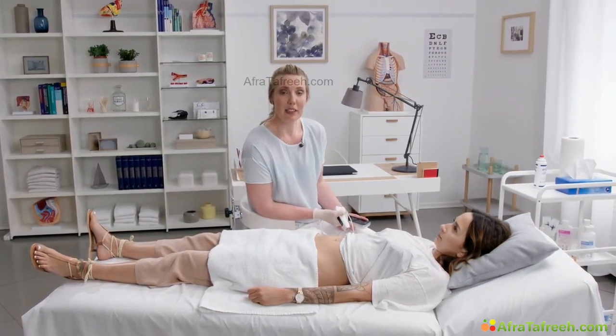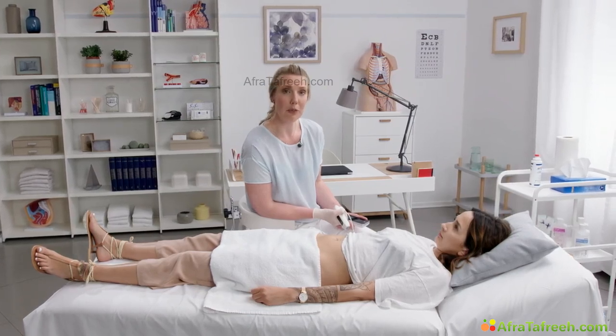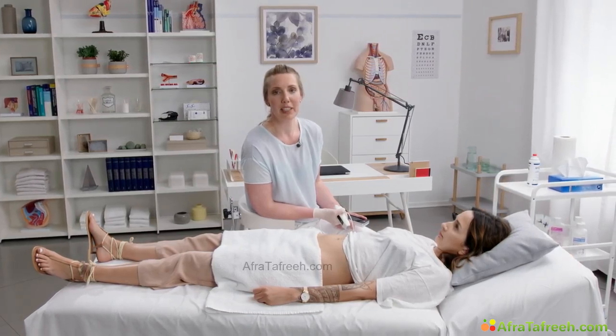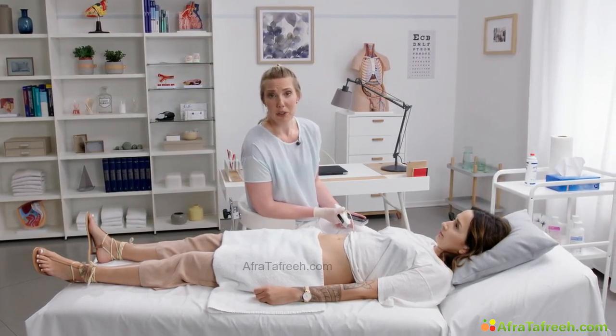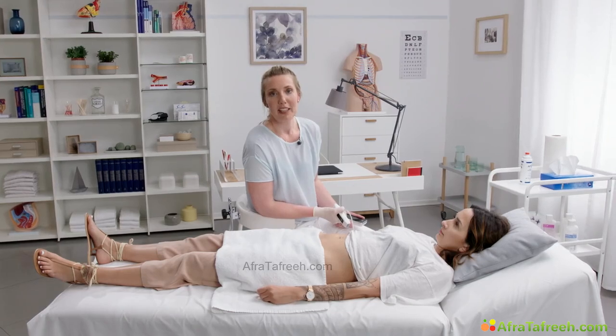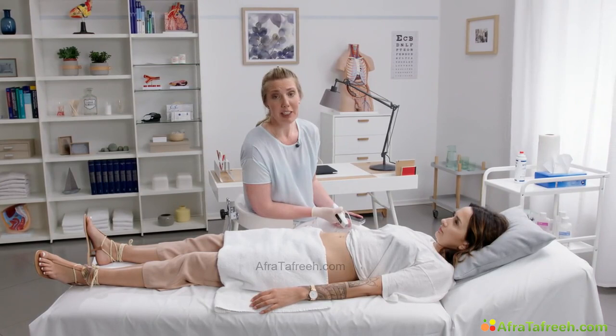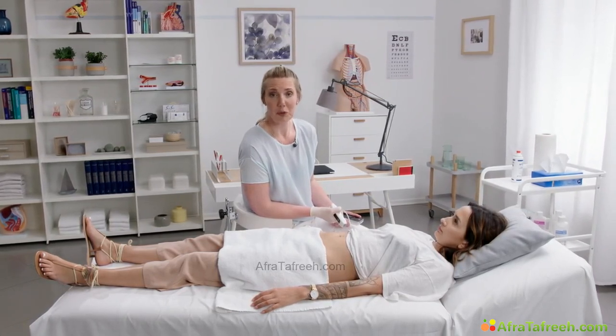Never lose track. Always follow your protocol so that you're sure that you've seen the full pelvic area. And of course, also in obstetric ultrasound, practice is the key word. The more normal pelvic areas you've seen, the easier it gets to recognize the extraordinary.